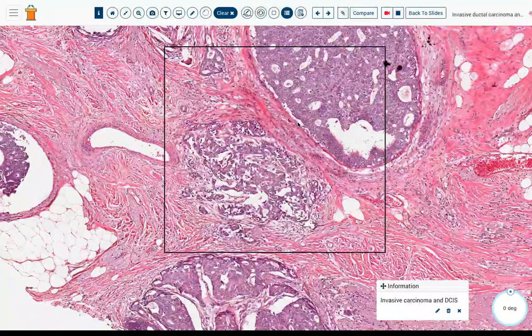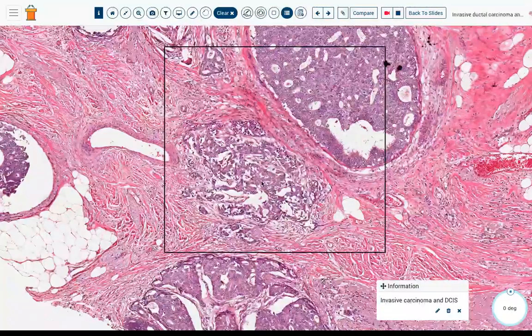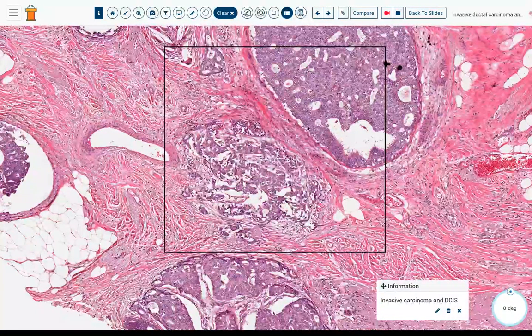In contrast, you can see this area of DCIS. And remember before we talked about DCIS being like a tiger in a cage. So both these cells and these cells can be exactly the same biologically, but these cells are effectively in a cage of this basement membrane where these cells are out of the cage. So it's like being at a zoo. As long as the tiger's in the cage, it can't hurt you, just as DCIS can't metastasize. But as soon as the tiger's out of the cage or it's invasive cancer, then it has the potential to be able to metastasize.